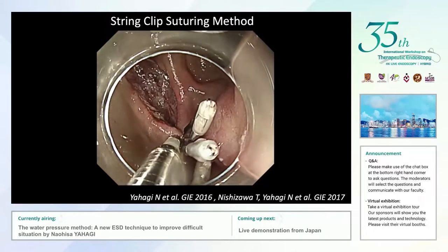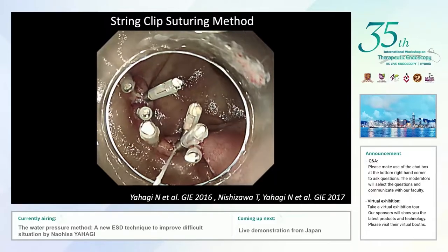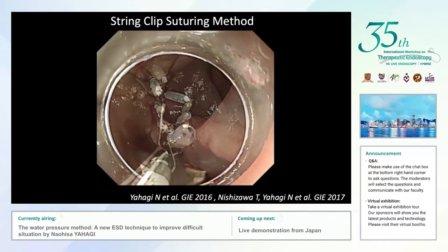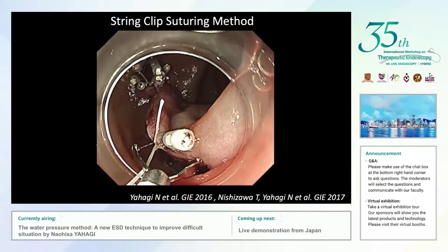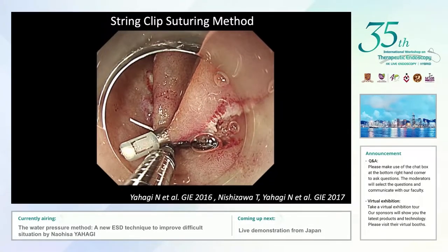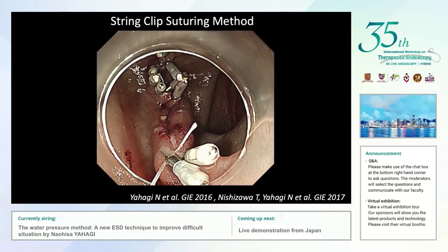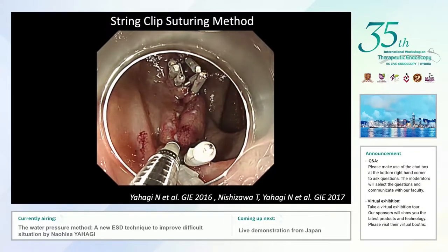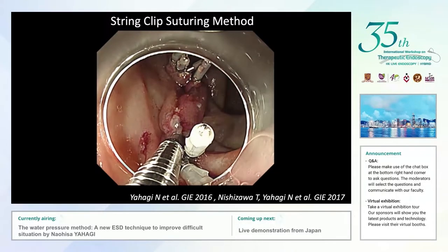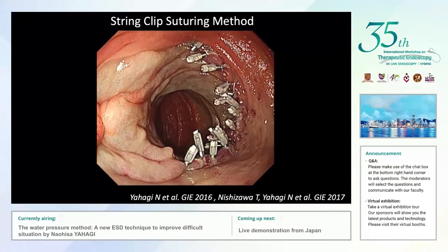After closing half of the defect, I cut the string with scissors forceps and applied a second surgical string end clip to the remaining mucosal defect. Again, I approximated the opening by pulling the string and applied additional end clips to close the mucosal defect. It becomes easy to close the remaining mucosal defect, and this is the final result.